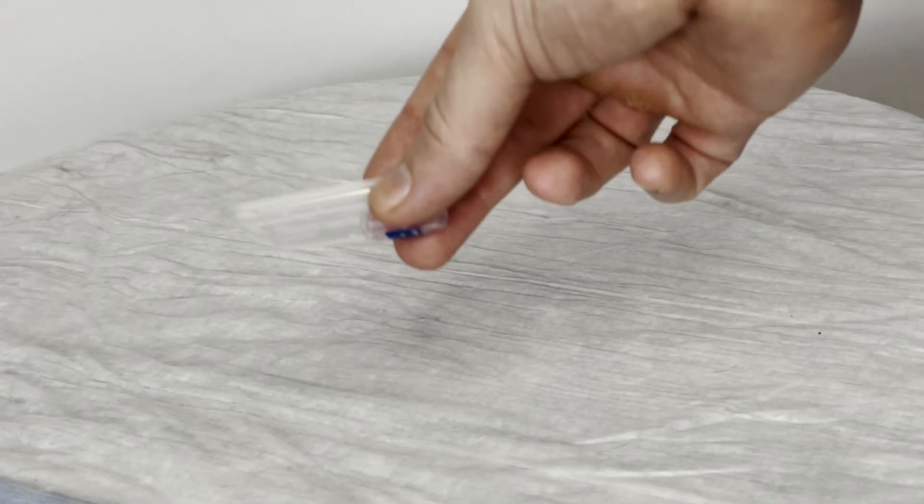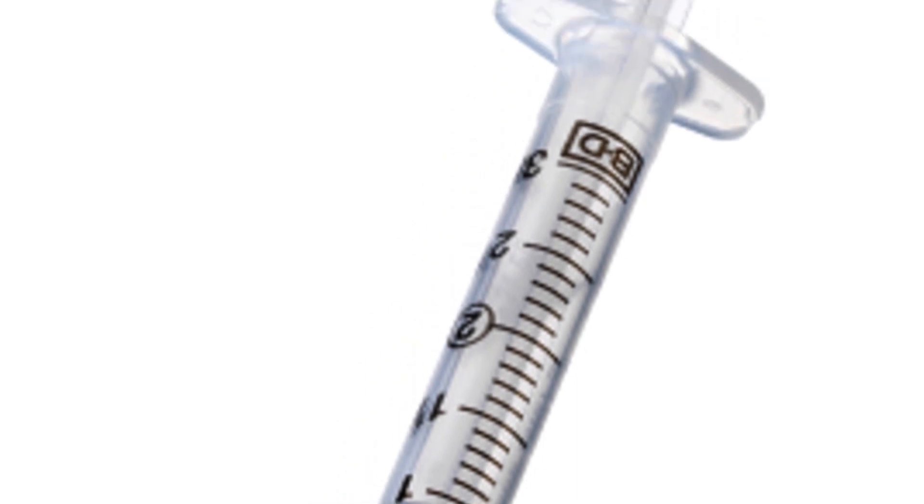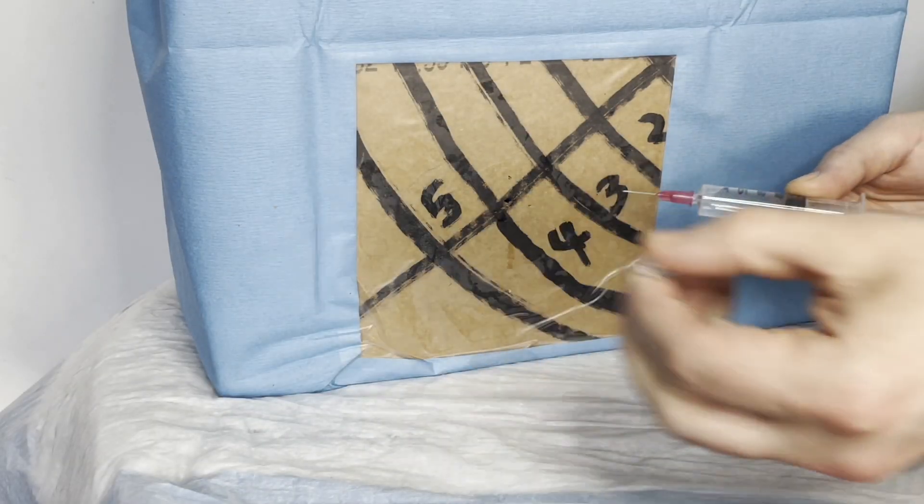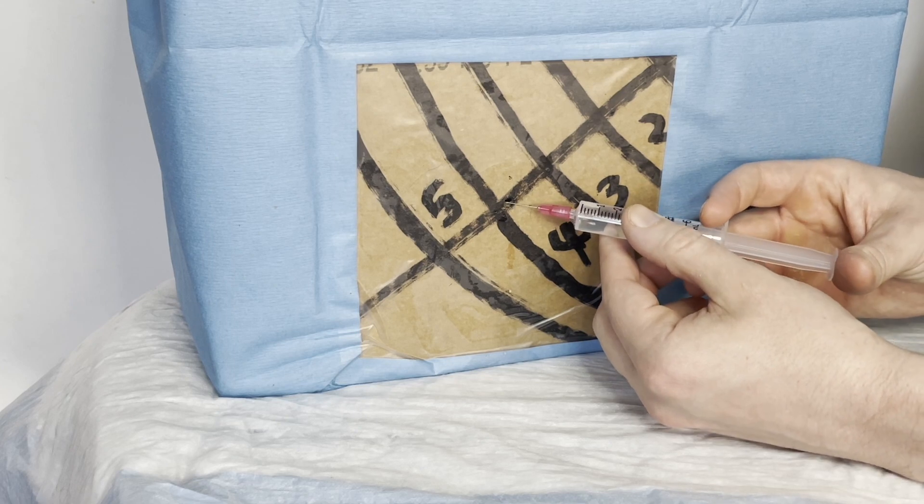And remember, our kit comes with two different needles to anesthetize the patient. Our patient is in our semi-upright position for this procedure. You have a 25 gauge needle and what we're going to do here is just create a wheel superficial into the space.